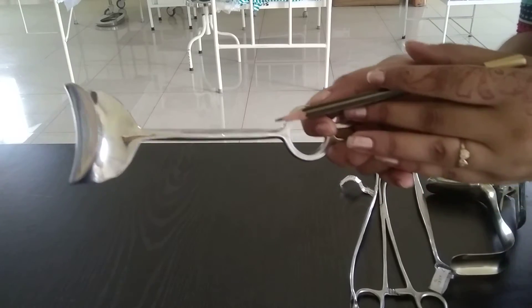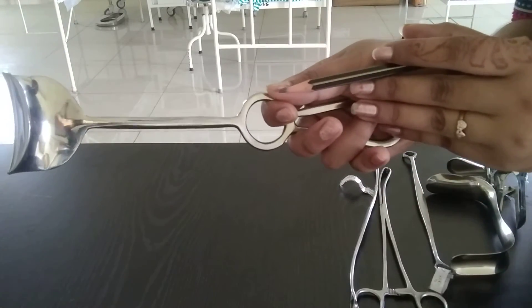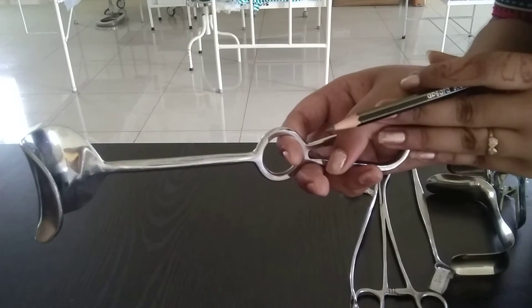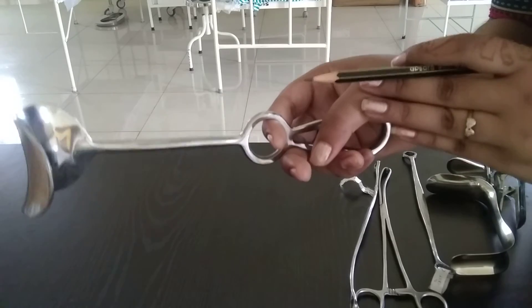It is used to retract the skin folds. In obstetrics, for LSCS — lower segment cesarean section — hysterectomy, and ectopic pregnancy.